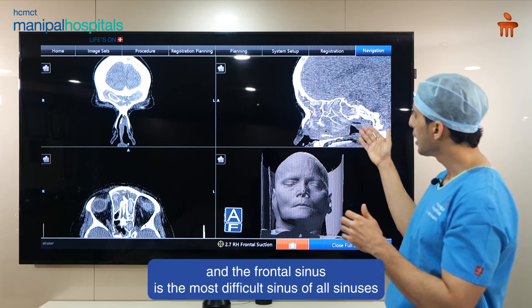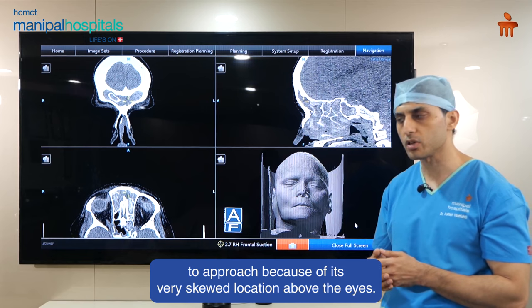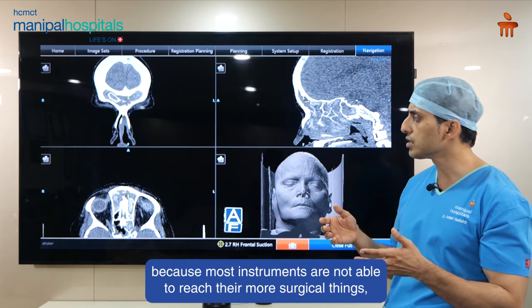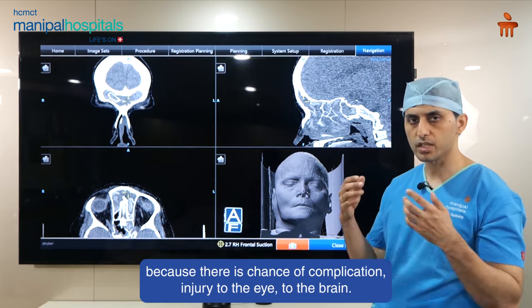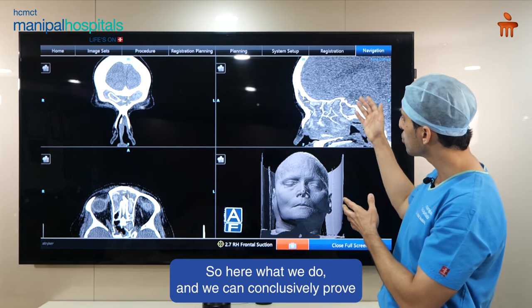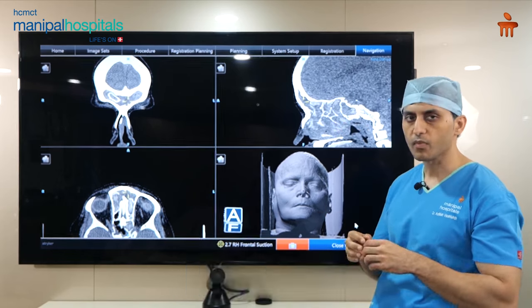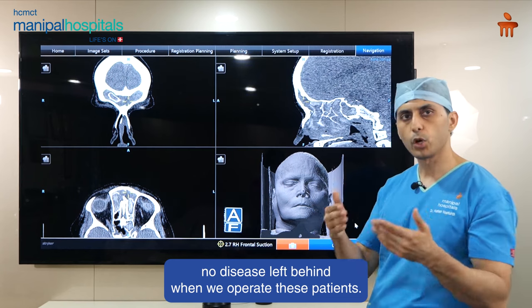The frontal sinus is the most difficult sinus of all sinuses to approach because of its very skewed location above the eyes. We see a lot of failures in patients who have been operated for frontal sinus disease because most instruments are not able to reach there, and there is a chance of complication — injury to the eye or the brain. With navigation, we can conclusively identify every single cell that leads our way into the frontal sinus, and we can be very precise and sure that there is no disease left behind when we operate these patients.